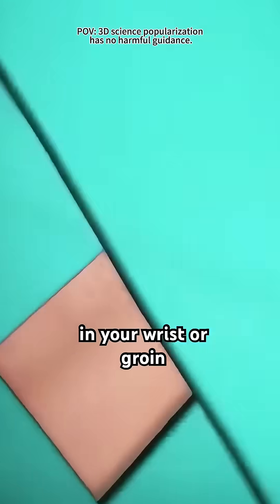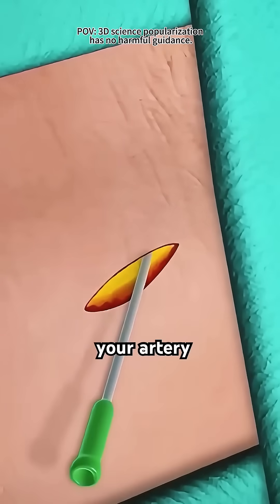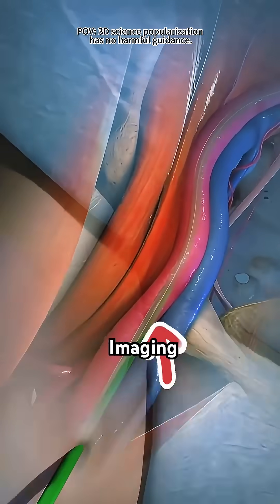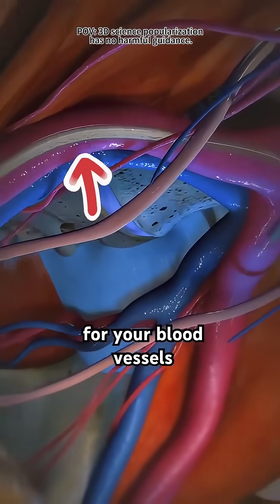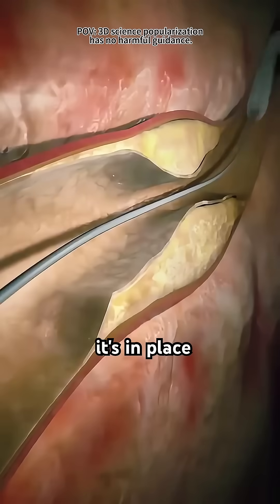The doctor makes a small incision in your wrist or groin, then threads a thin, flexible catheter into your artery. With the help of x-ray imaging — kind of like a GPS for your blood vessels — the catheter is carefully guided to the blocked spot.